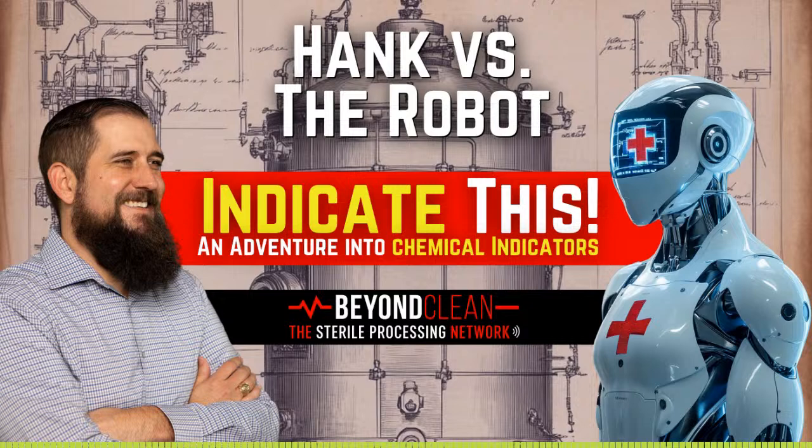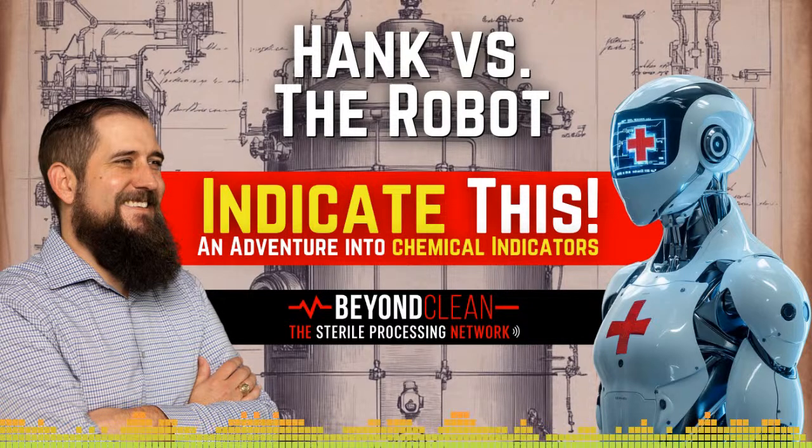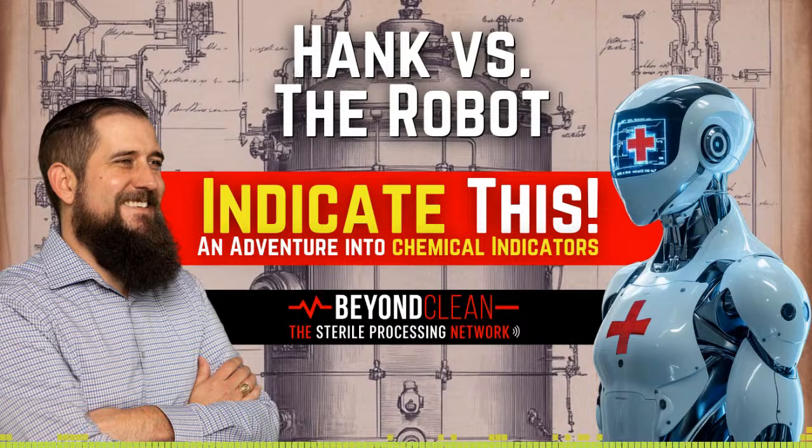Avoid overloading. Overpacking a sterilizer or improperly stacking trays can compromise sterilant distribution. Good load configuration supports proper indicator and integrator function. Consistency matters. Develop a standardized protocol for placement so that all techs in the department are performing this step reliably. In essence, proper placement is about challenging the sterilizer to perform its best.